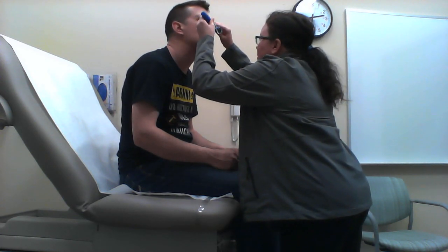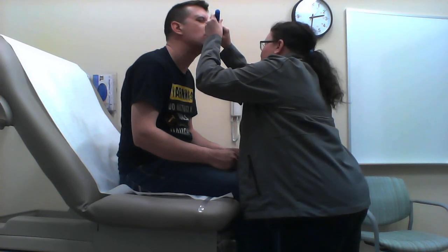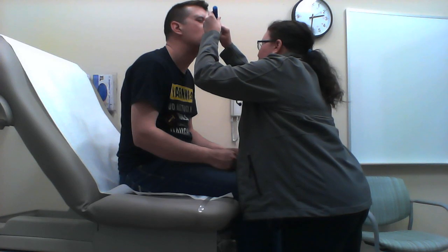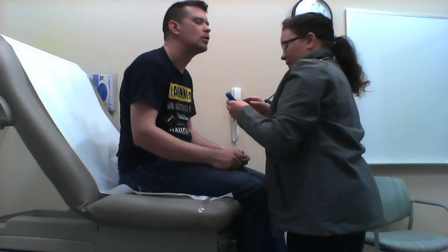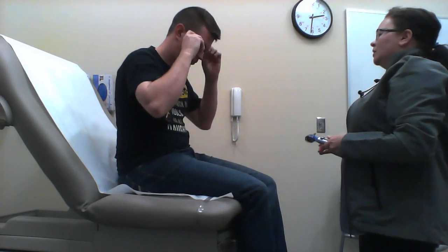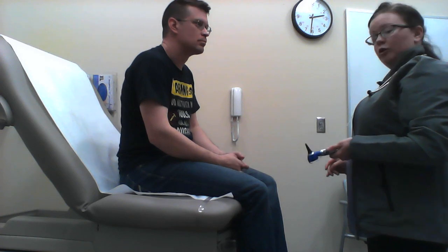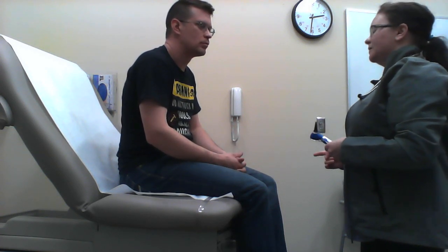Look at the nasal mucosa, which is nice and pink. That's normal. Turbinates are nice and pink, no swelling. Septum is a little bit deviated. That is normal. I'm going to also use this opportunity to palpate the sinuses.